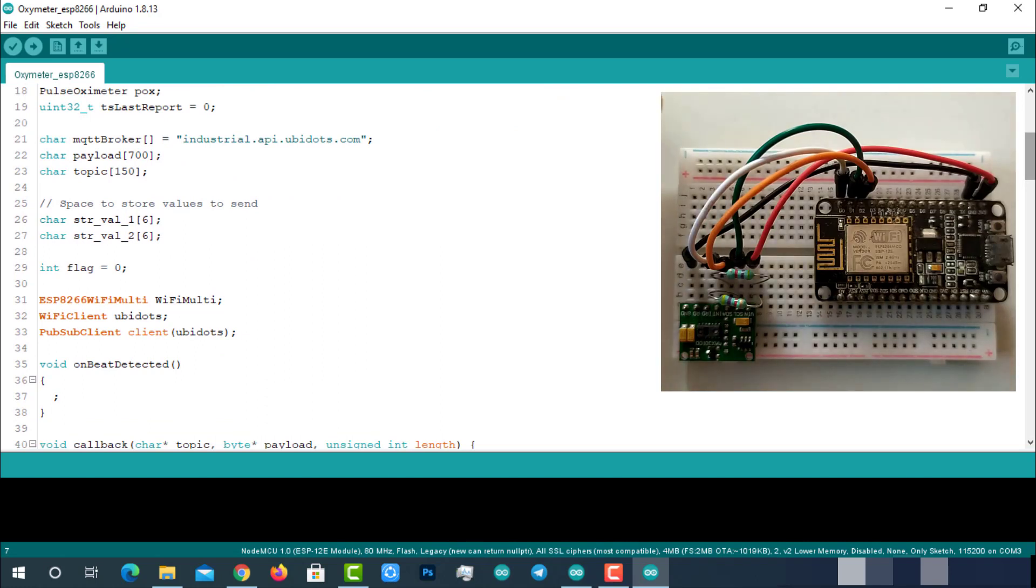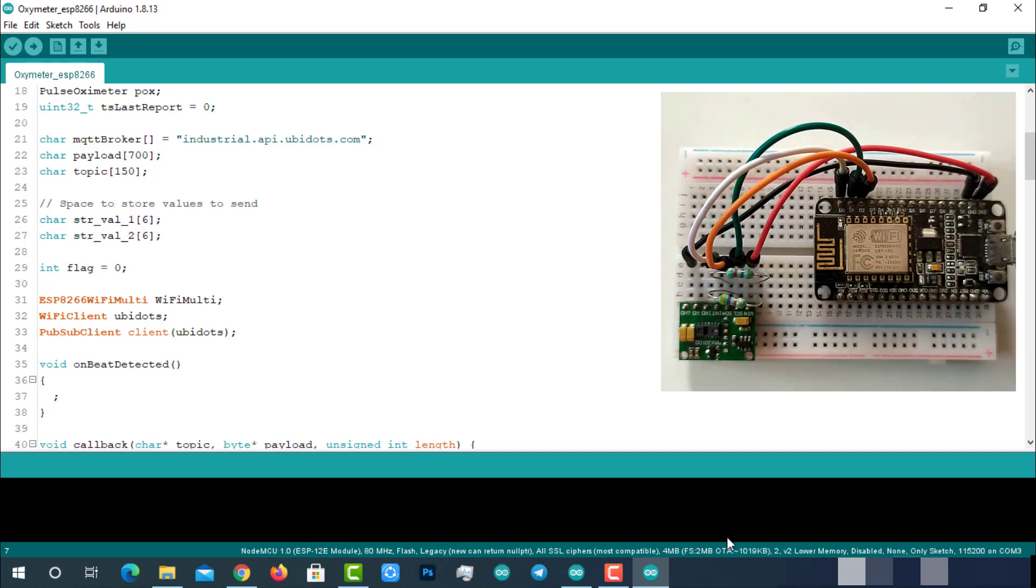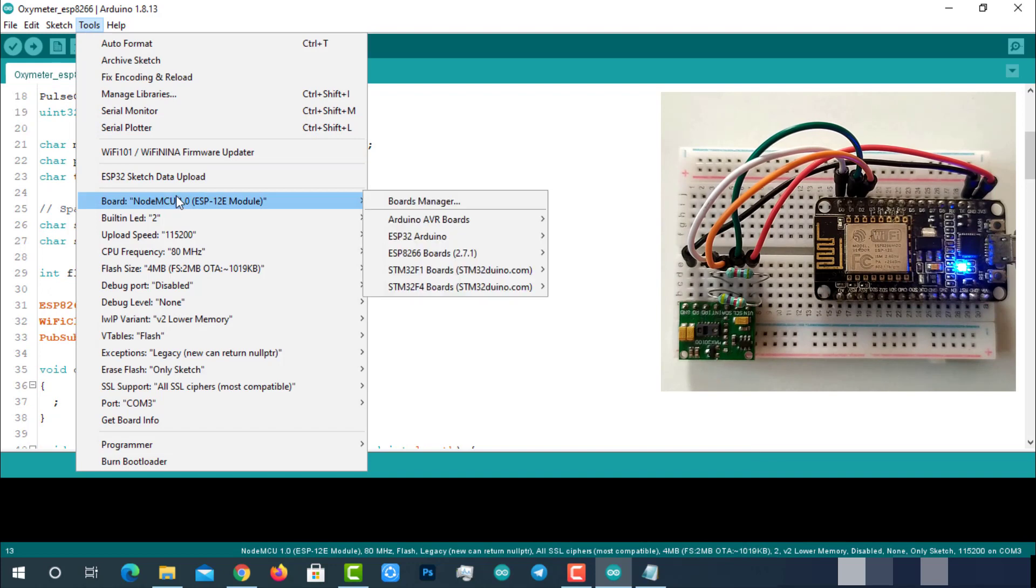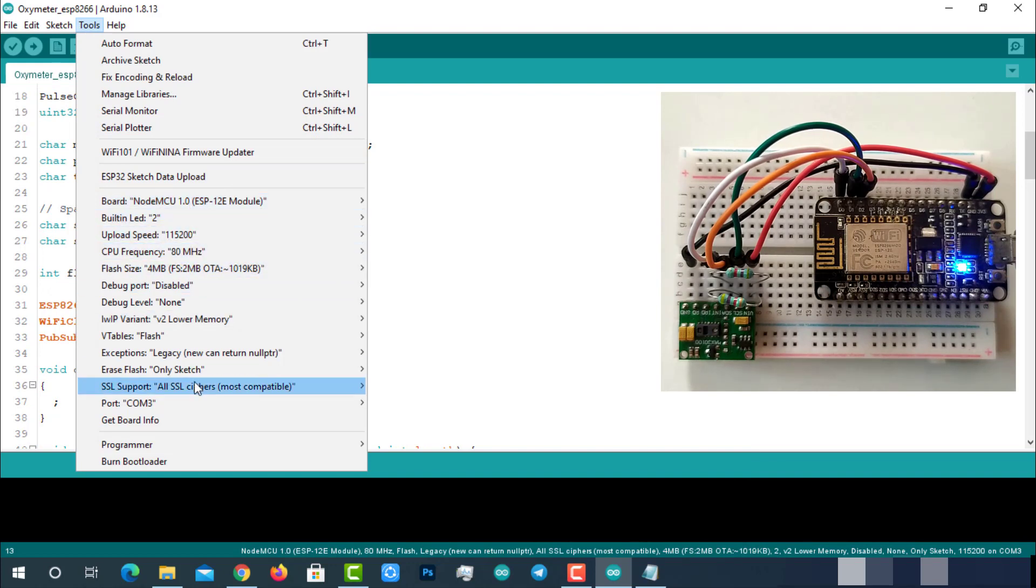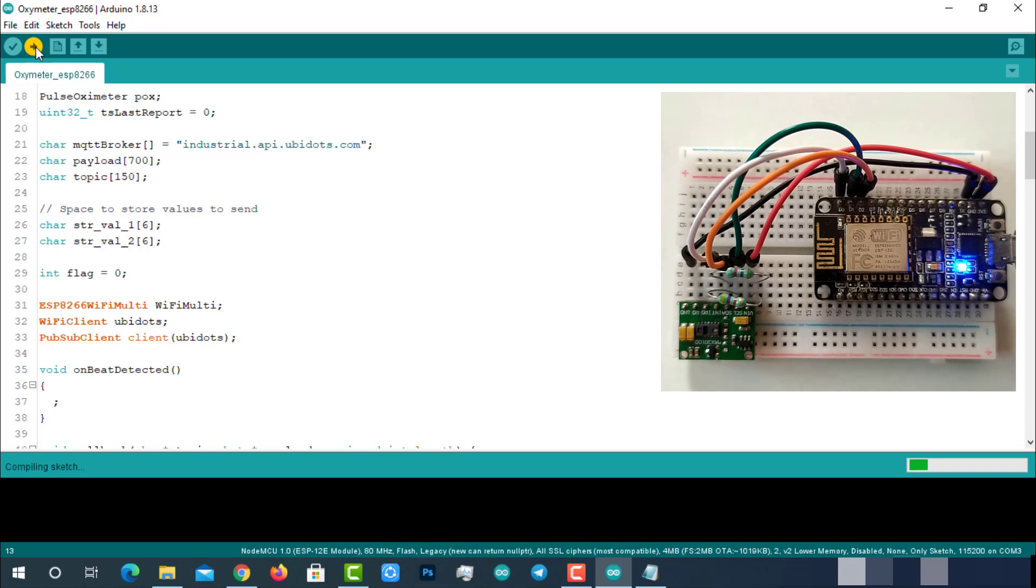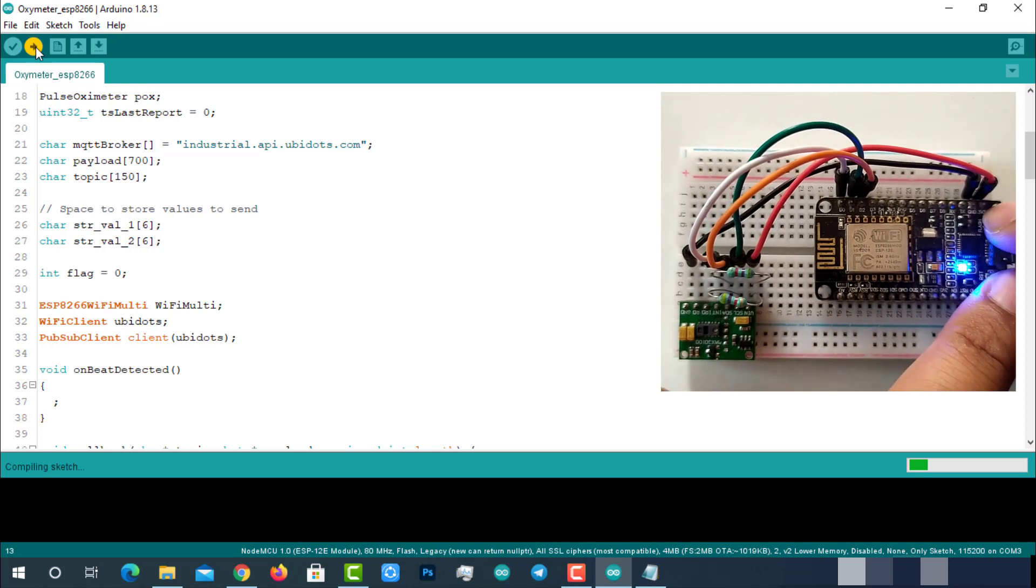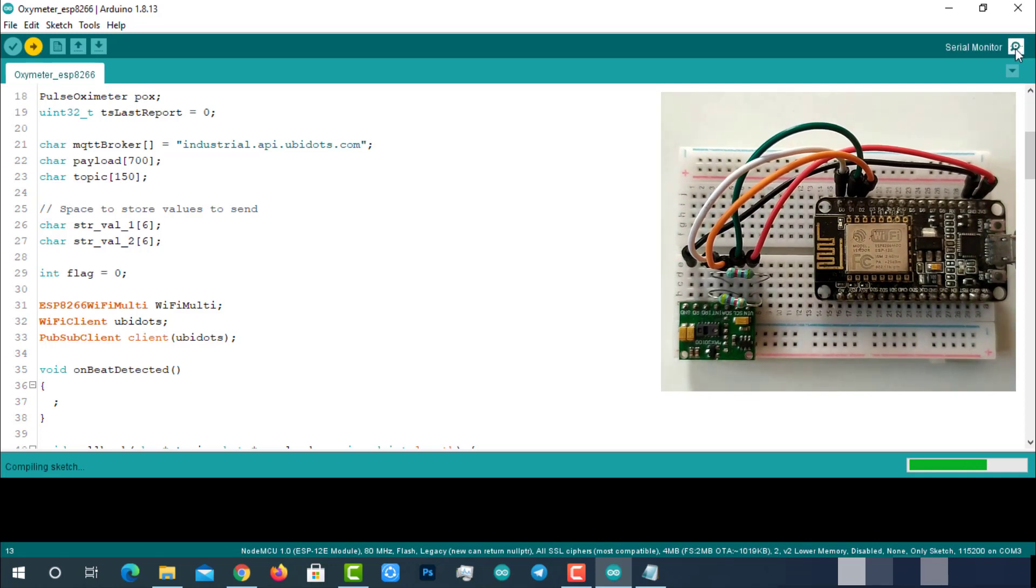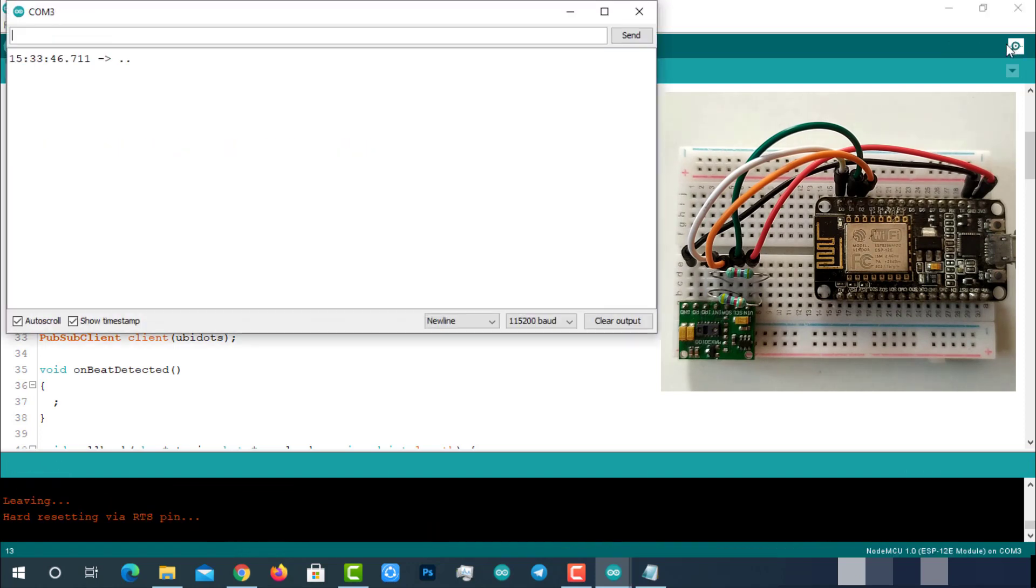Connect the ESP8266 module with laptop. Check the uploading configurations like board NodeMCU 1.0 ESP-12E module, uploading speed, and select the right port. If everything is okay, upload it. While compiling is in progress, put the ESP8266 in programming mode by pressing the reset button while holding the flash button, then release it. After successful uploading, open serial monitor.